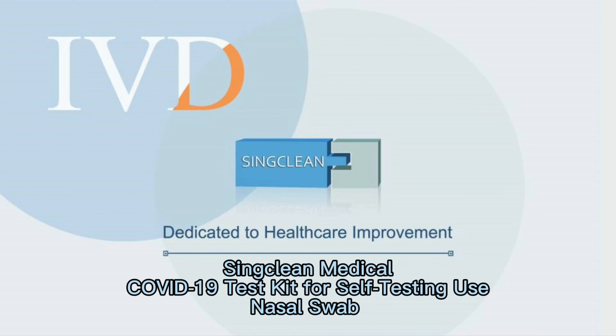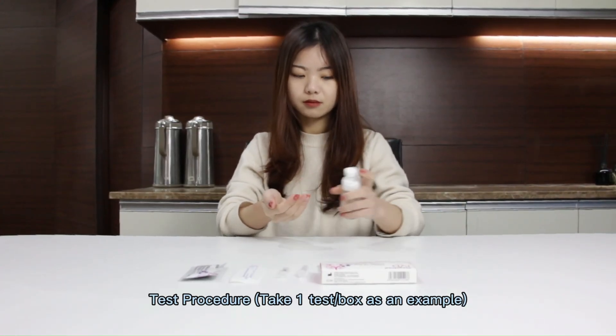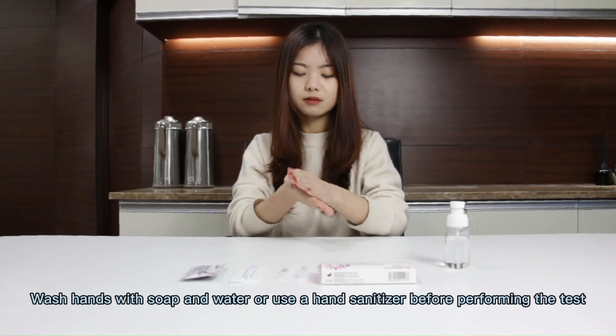Singclean Covid test. Materials supplied. Test procedure. Wash hands.